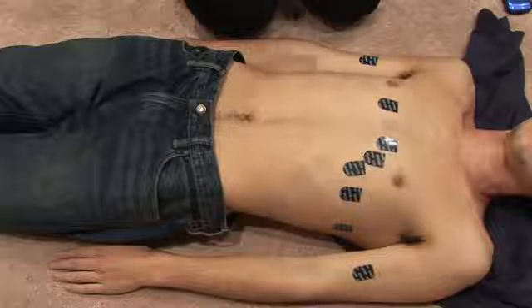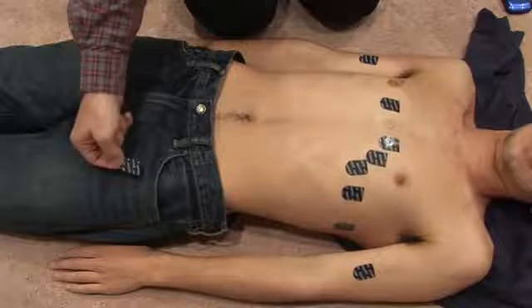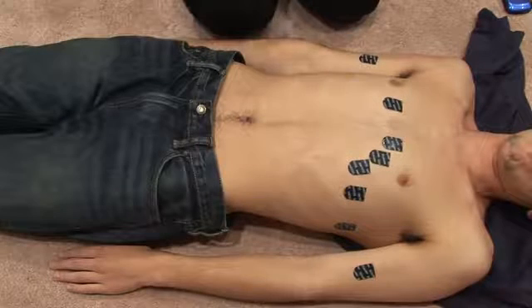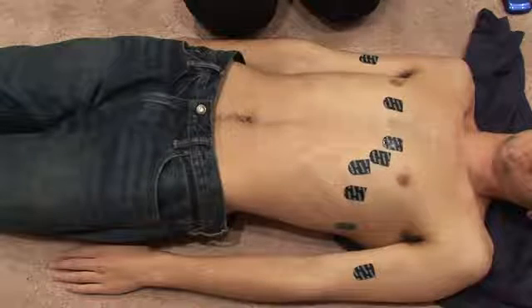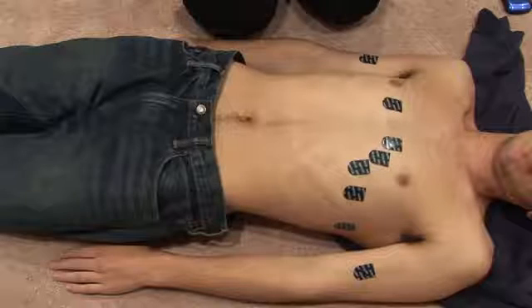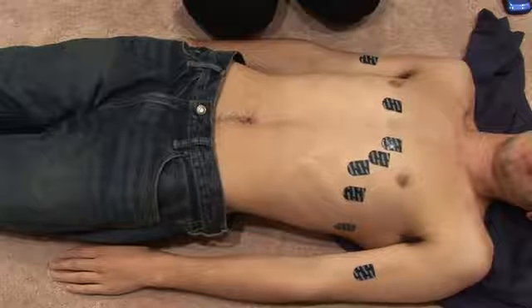And then the leg electrode should go on the legs, somewhere down on the calves or the thighs. Depends on what kind of access you have to the patient. And so that's where they belong. And I'm going to show you some pictures of where not to put them in just a moment.